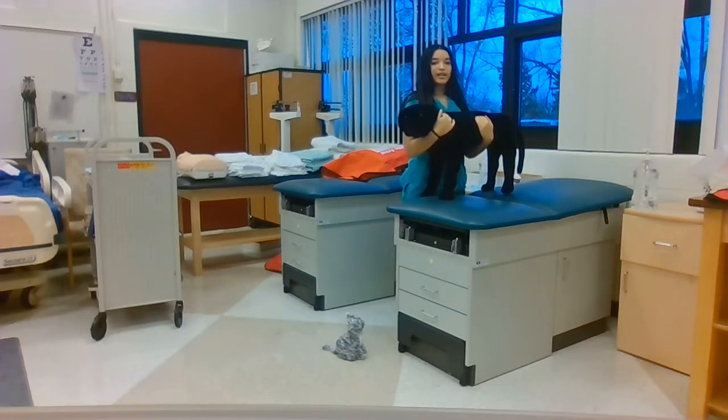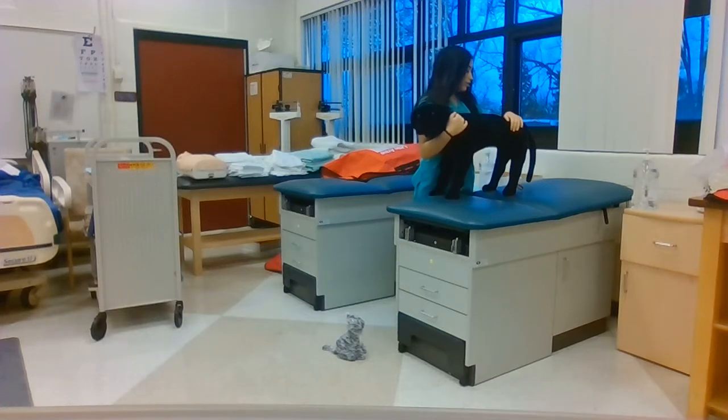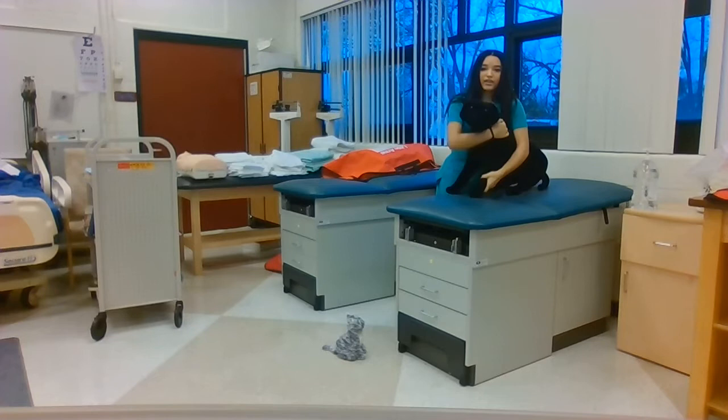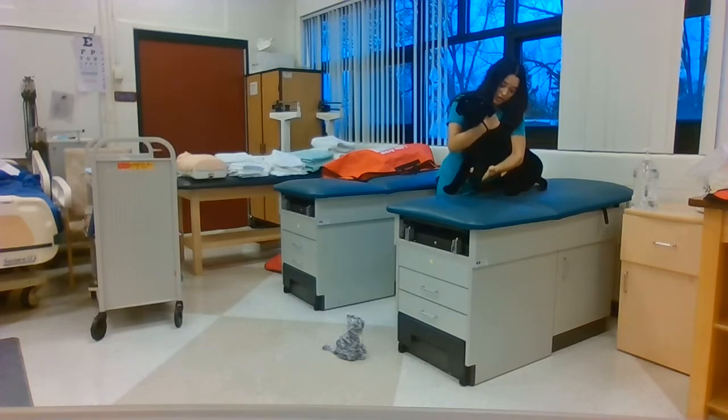Now I'm going to simulate a cephalic venipuncture, putting pressure on the rear of the dog, getting the dog into a sitting position and moving my hand across the dog, placing the elbow of the dog's leg that's opposite from my body into the elbow of my hand. I'm going to rotate my thumb laterally to occlude the vein and wait for the blood to be drawn.